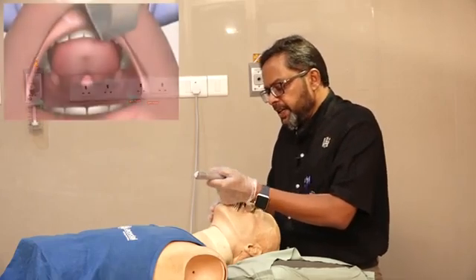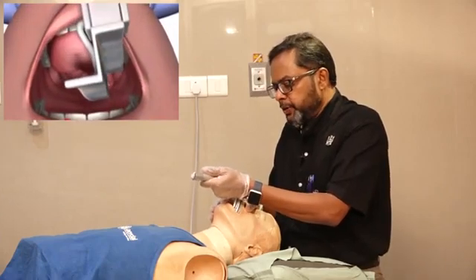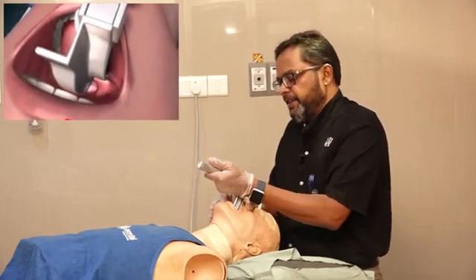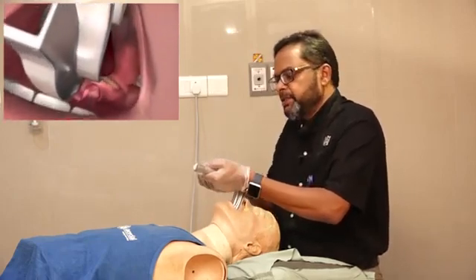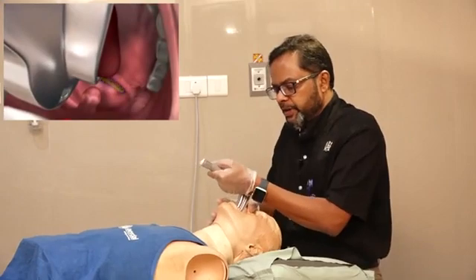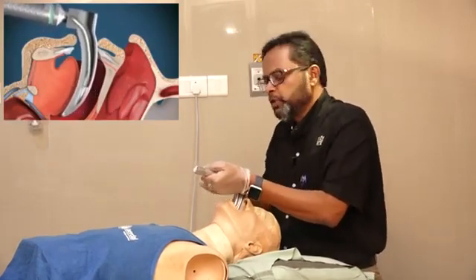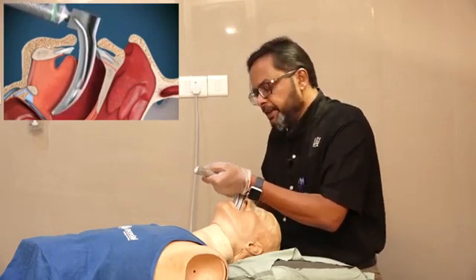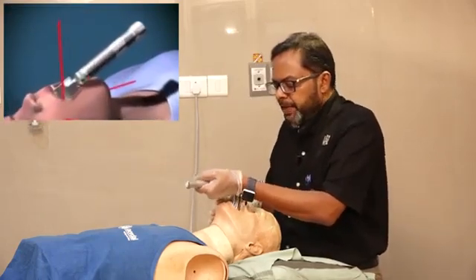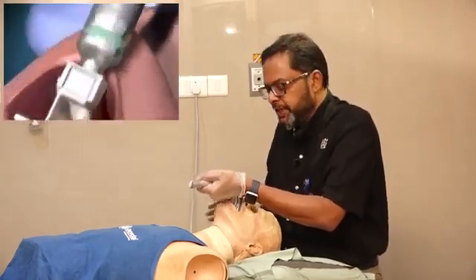Once you see the tip of the epiglottis, advance further to the glossoepiglottic junction, then elevate. Do not apply pressure like this — just lift the lower jaw with the laryngoscope. Many people will do a levering movement, but if you do a levering movement it will injure the face.